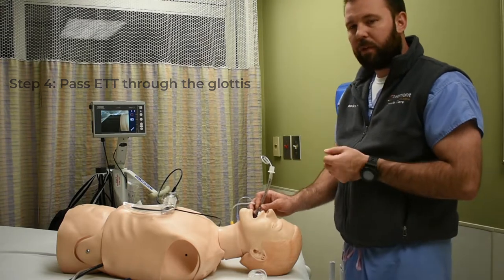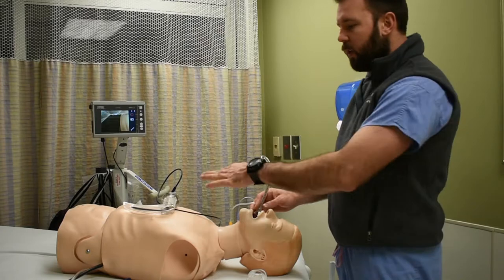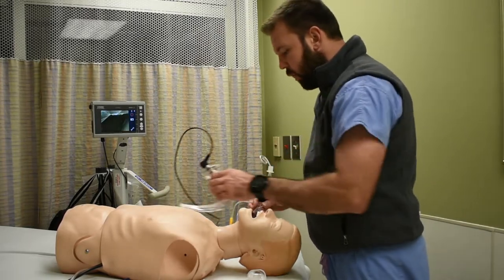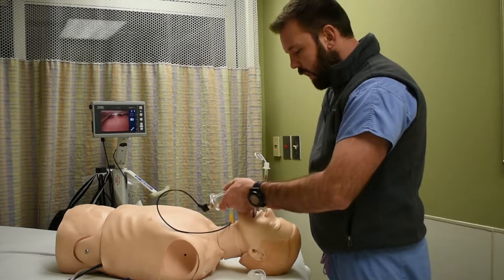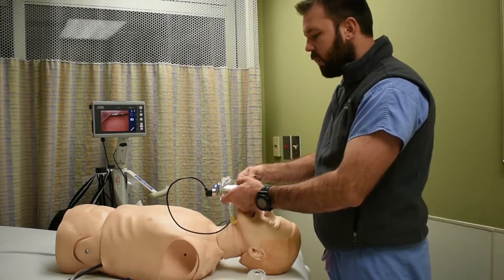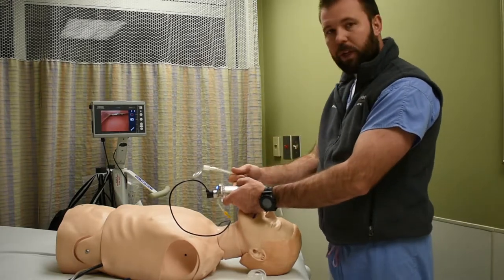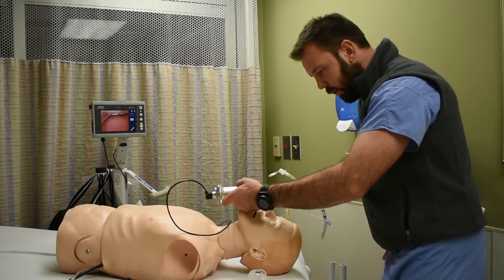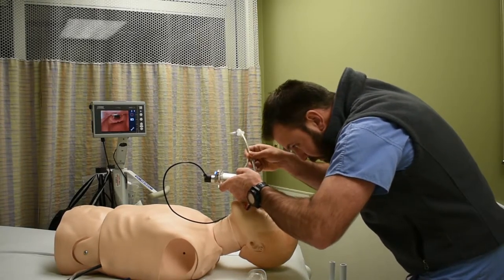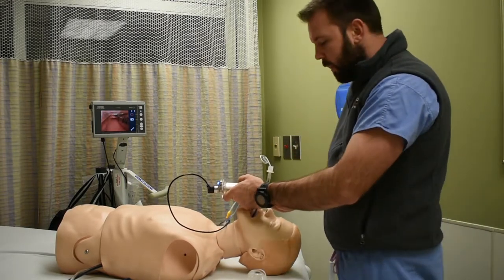A couple of things you may have noticed: we don't need to sweep the tongue out of the way with the video laryngoscope method. Another pointer is that if the screen becomes clogged with debris, with a Mac 3 or Macintosh 4 blade you can transition to a direct view and just use direct laryngoscopy to intubate the patient.